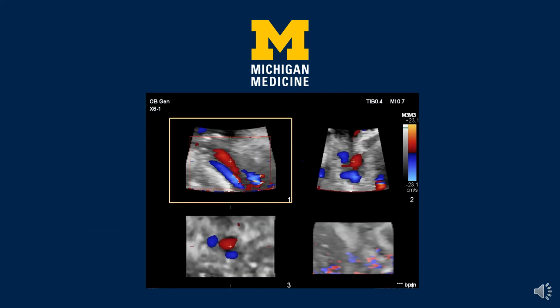This is a typical display of a 3D acquisition. The upper left-hand image is an acquisition along the length of the umbilical vein and umbilical arteries. The umbilical vein is red and the two umbilical arteries are blue. The transverse image, which would correspond to rotating the probe in a perpendicular orientation if this were a standard 2D acquisition, is in the upper right-hand image, and it shows the umbilical vein and the two umbilical arteries.